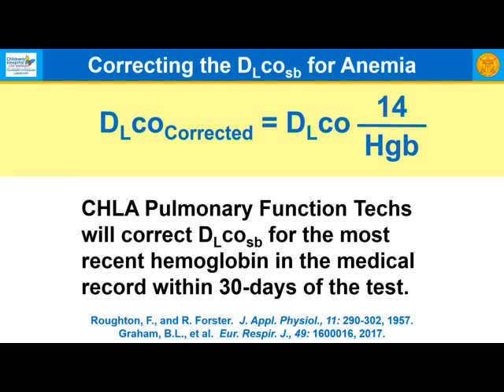And so I went and found that the diffusing capacity was indeed low, which correlates with pulmonary vascular disease. But of course, she has thalassemia, which is an anemia. And as luck would have it, she had a CBC drawn on the same day. So when I corrected the hemoglobin as per this formula, it turned out to be normal. So in fact, she did not have pulmonary hypertension. She just had a diffusing capacity which was uncorrected for hemoglobin.